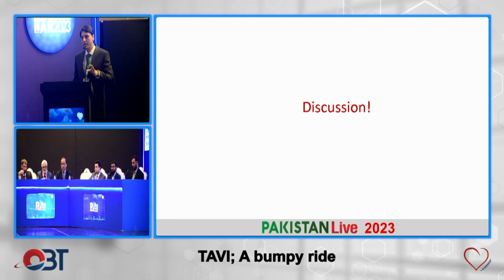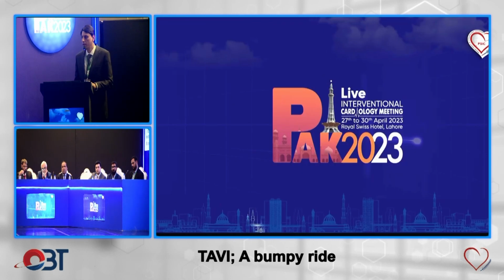So this case, I looked up into the literature. There had never been such a case reported where they went across the valve through the graft. There have been cases of simultaneous coarctation of aorta repair with stenting and then performing the TAVI. So I'm open to discussion.